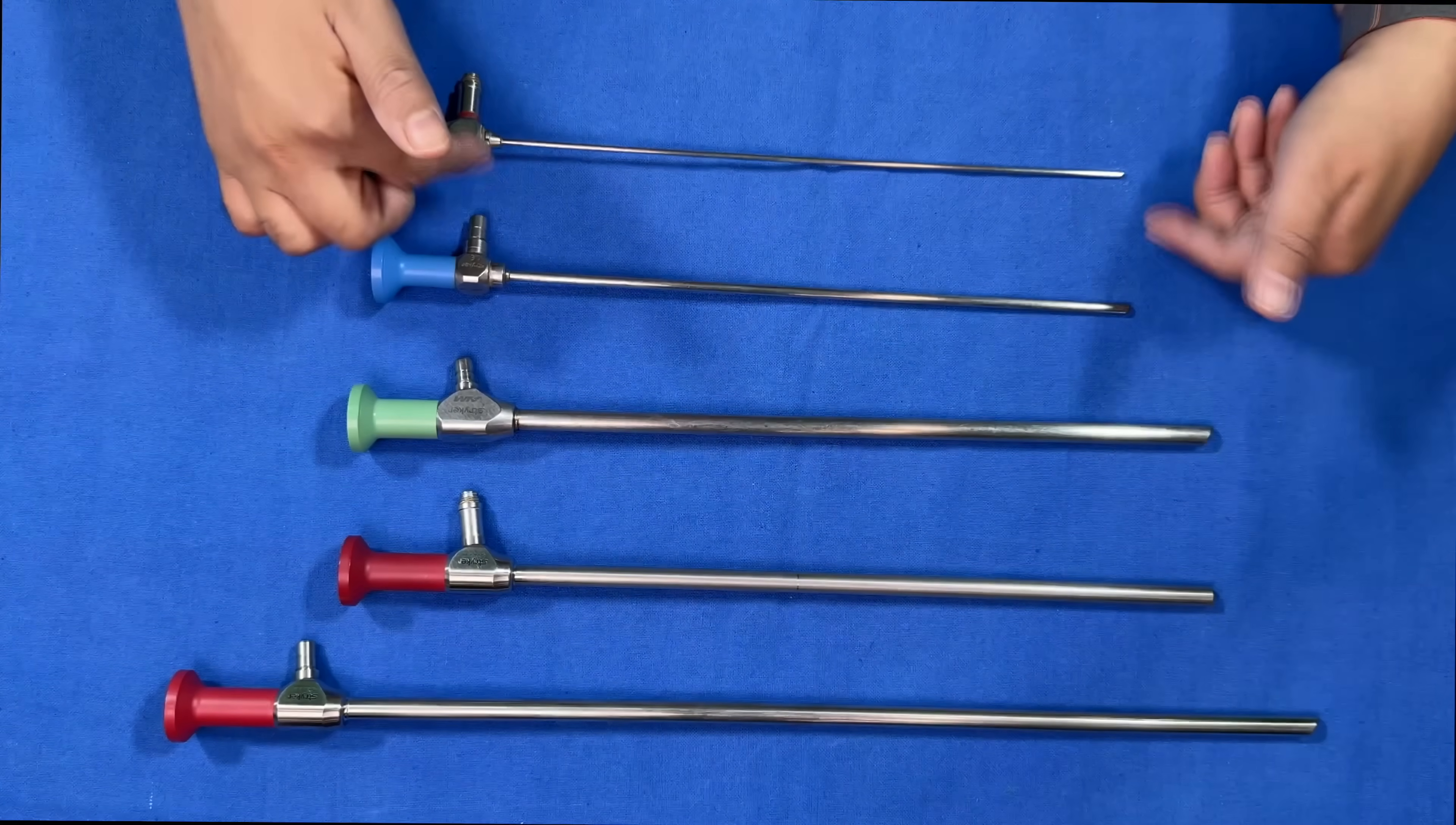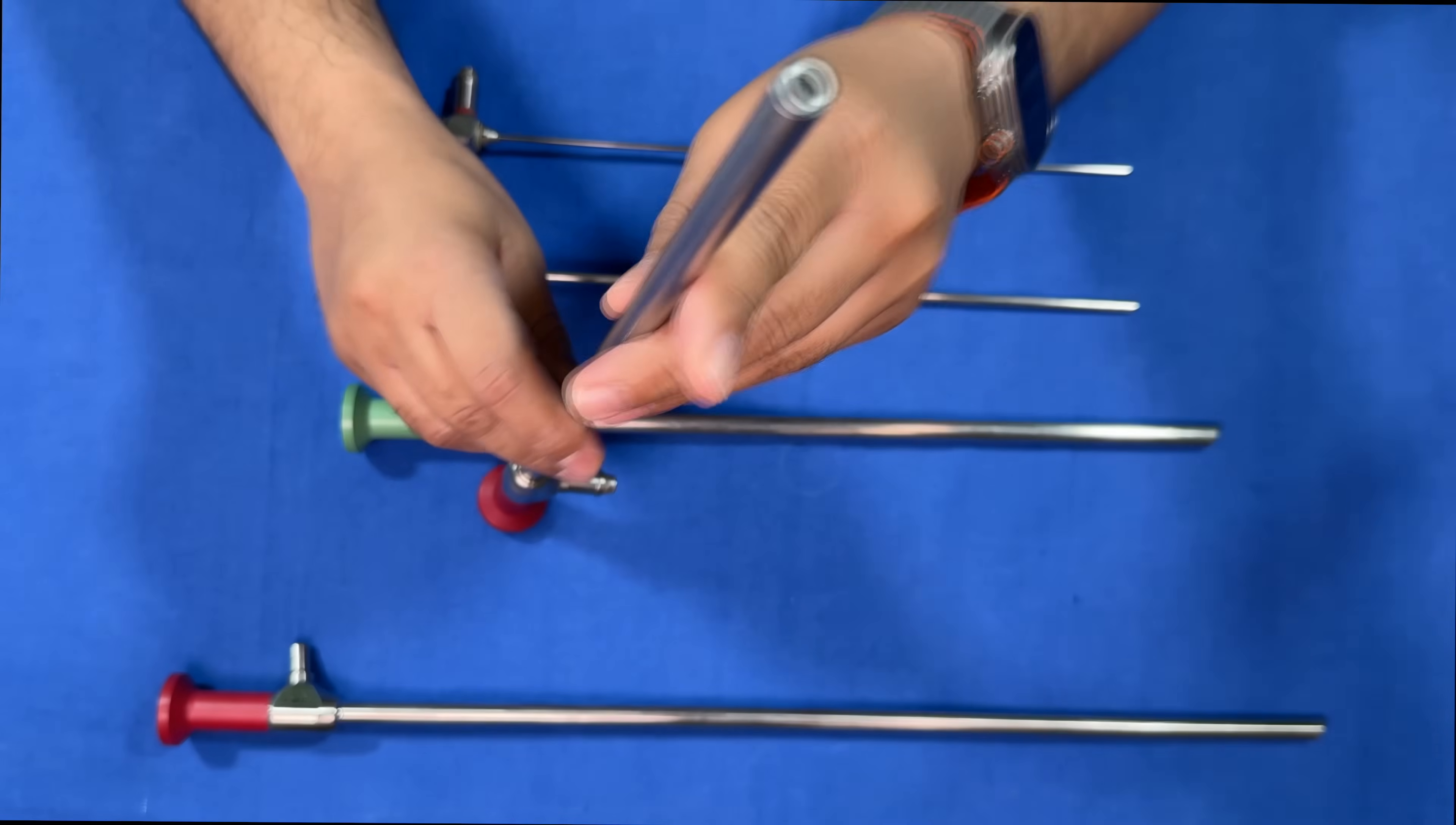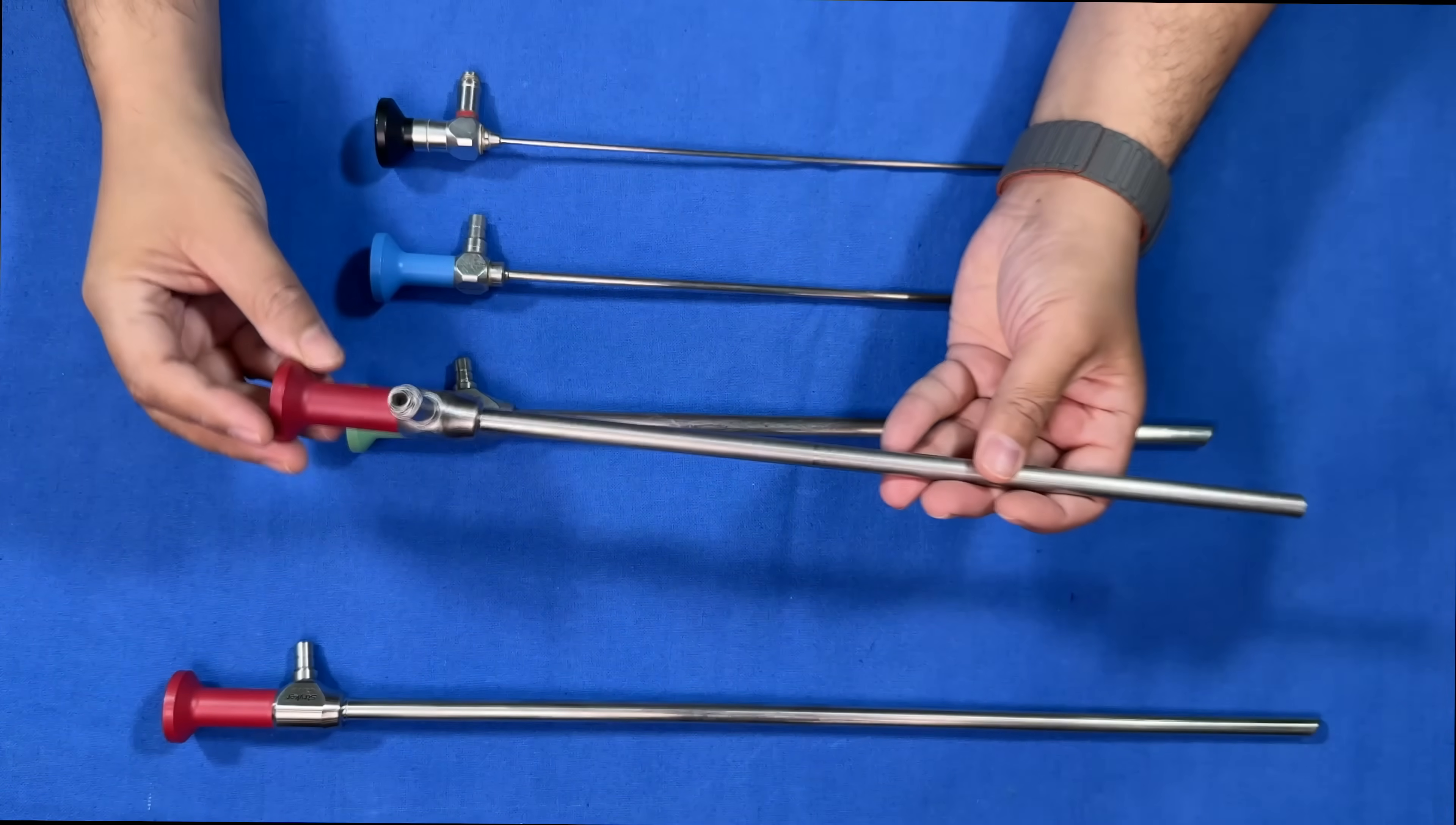This one has 34 centimeters, again 34, and these two scopes have a length of 30 centimeters. Depending upon the angle of the tip, some scopes have a flat angle like this one. It does not have an angle at the tip, so this is called a zero degree.